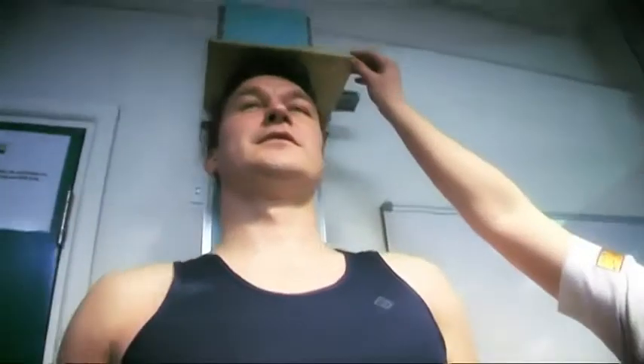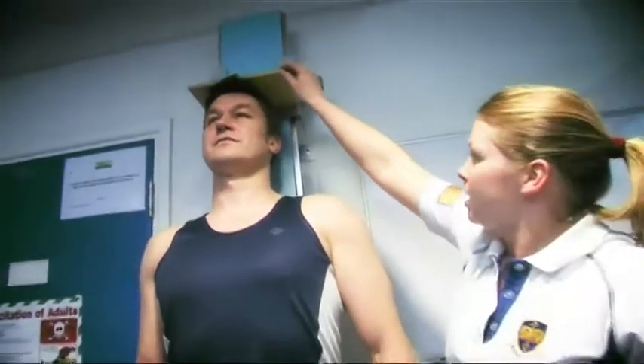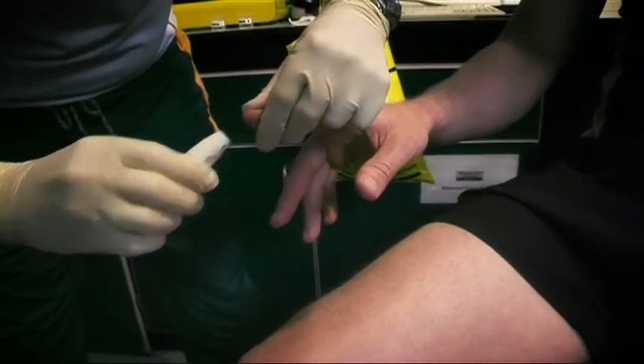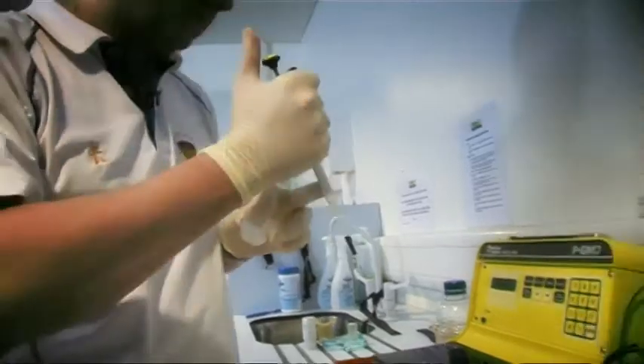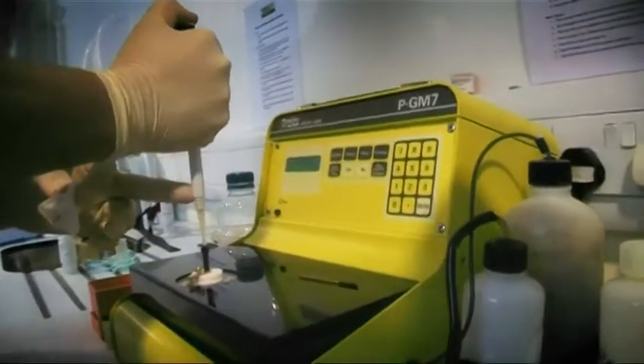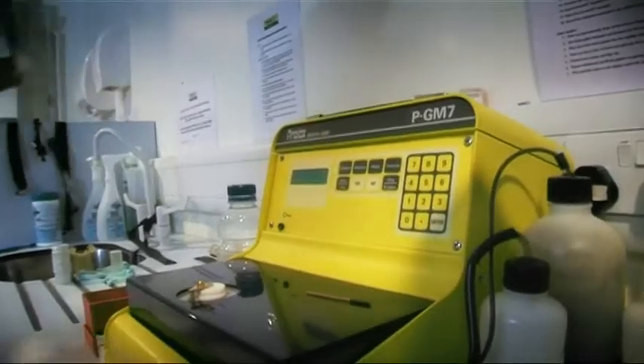The data we need prior to the start is really the same as for all physiological assessments — we'd need your age, your sex, your height and your weight. Then we'd take some baseline measurements such as resting blood lactate and hematocrit hemoglobin, which are just normal baseline blood scores, and then we would progress into the test itself.